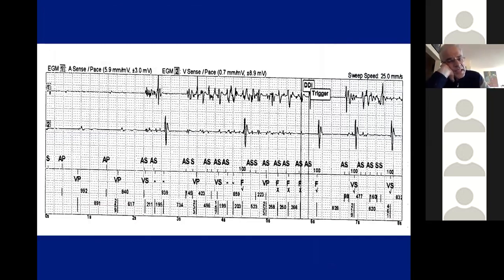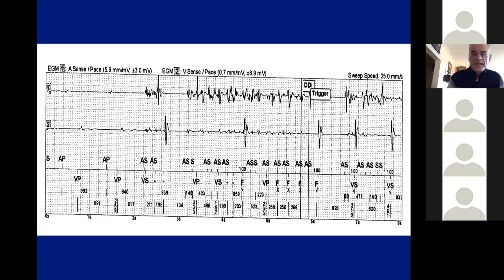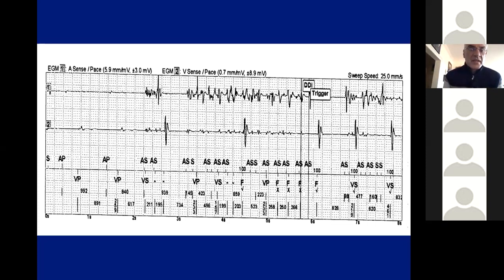Here is another example of noise. This is a dual-chamber electrogram — atrial channel on top, ventricular sense channel, and markers. What kind of noise is this? It's likely EMI — electromagnetic interference — because you see it on both channels. If you saw it on only one lead, you'd suspect something wrong with that lead. But if it's on both leads simultaneously, the chances that both leads failed at the same time is much less.